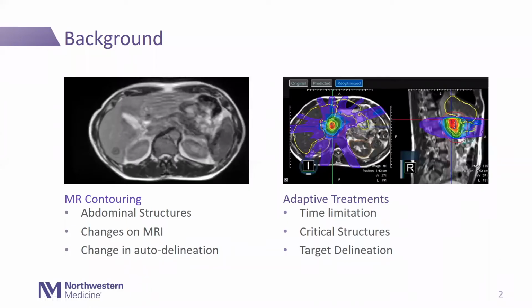As many of us are aware, instituting an MR-Linac causes a lot of changes in the program. It's changes with how you plan radiation, how you implement radiation, and also how you teach radiotherapy planning. For physicians and residents, it requires doing abdominal structures, especially in pancreatic cases, which are really common for MR-Linacs, on MR imaging, especially on low field images like you can see here. They're often very fuzzy and not as clear as higher powered fields like 3 Tesla.